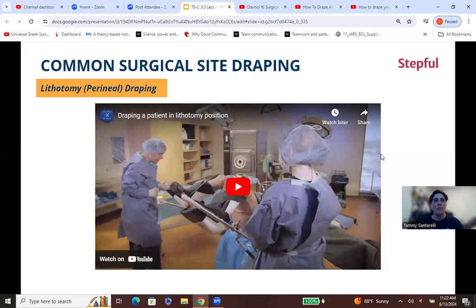So the most important thing that you need to remember is where you're at, what's next to you, so you do not contaminate. Again, if you put this drape in first, there's nothing on these legs that are protecting you. So if you rub against them, you may need to get a sterile sleeve to put on, or you may have to totally regown and reglove. You have to be aware in your surroundings. You have to know what's around you.